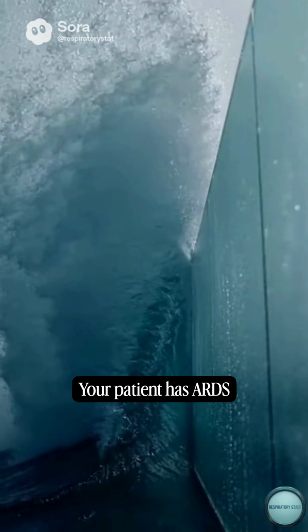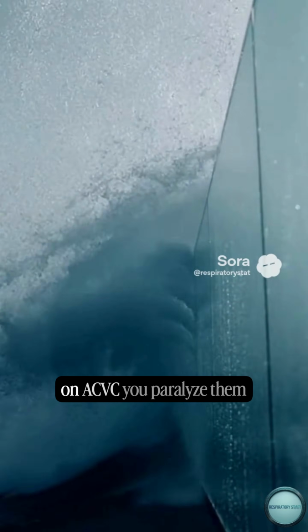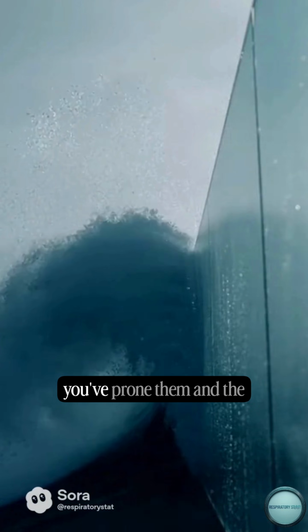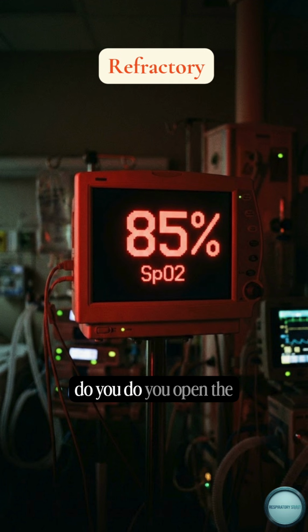Your patient has ARDS, the PF ratio is tanking. You've cranked the PEEP on ACVC, you've paralyzed them, you've proned them, and the SATs are still 85%. What do? You open the lung and you keep it open.